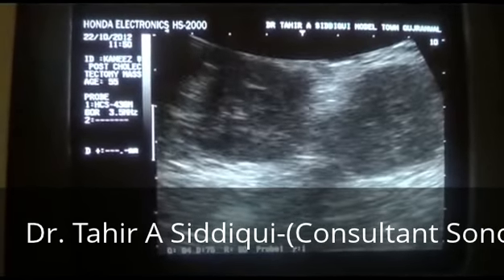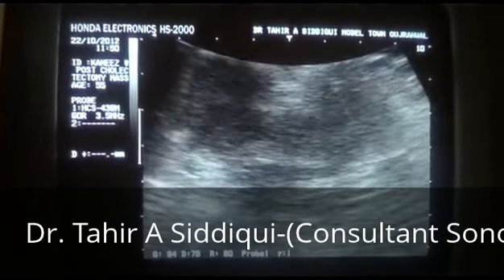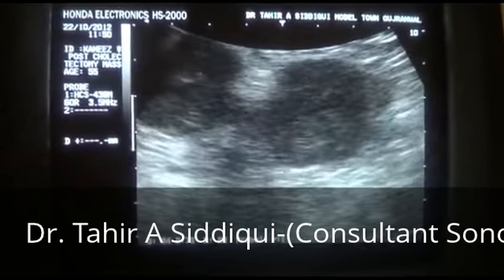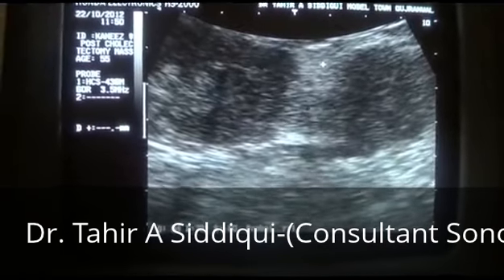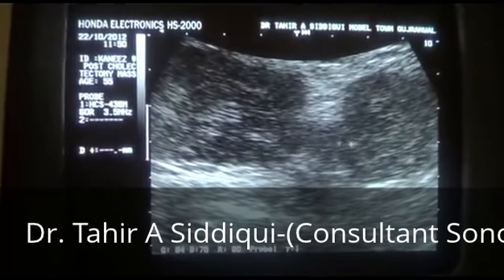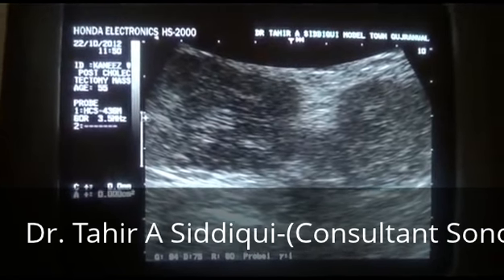So these are extraperitoneal masses with internal calcification in the subcutaneous region, communicating with each other in this region. So these are the two masses.